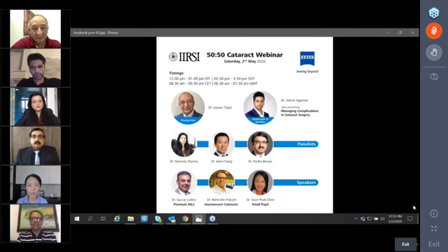And of course, if you are worried that the iris will not be able to dilate nicely because it's been chronically inflamed and there can be fibrosis, then you use, again, iris hooks, because it's very good in that you can titrate the size of the pupil. You can slowly expand it bit by bit. And the iris hooks can actually allow you to expand one area more than the other, which is not what you can do with the Malyugin ring. So I think especially for the uveitic eyes where the pupil has been stuck and adherent for a long time, and if you're not a frequent user, please use the hooks. They are so much safer to use. Absolutely.